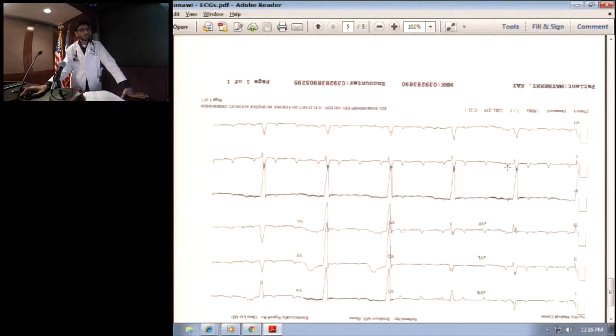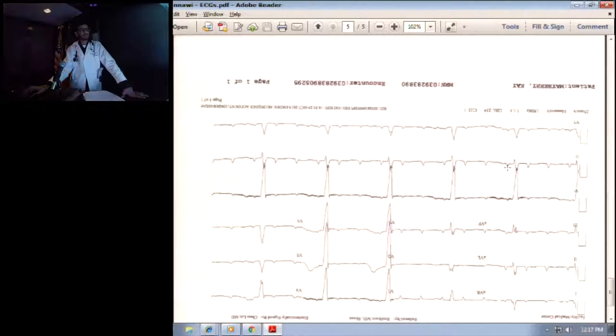Yeah. Very good. That person also has heart block at 50. Now that's going to be a higher... No, no, no, no. That's a complication. So right, let's put the baseline EKG. The RV systolic pressure is going to be higher because there's more filling time. Yeah, but let's go to the baseline EKG, please. I didn't scan the baseline EKG.